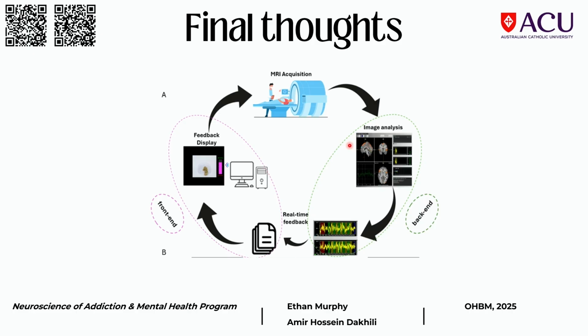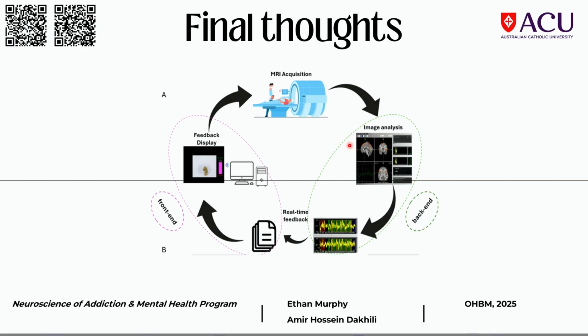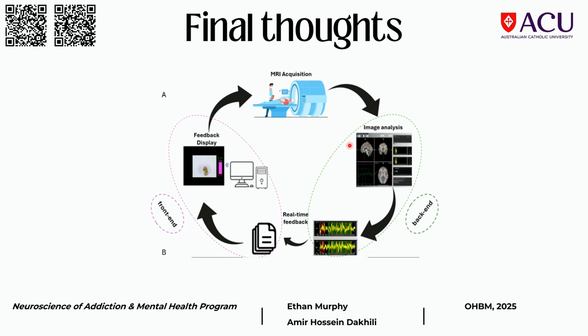Yeah, and as Ethan mentioned, from some stage you feel that any feedback calculation, everything is correct, everything is there, and you suppose that it should ideally run. But I would say there are just a couple of things. The one thing that could help us at some stage was just to have a checklist of those couple of actions you need to do before running the experiment, on the day and before running the task.